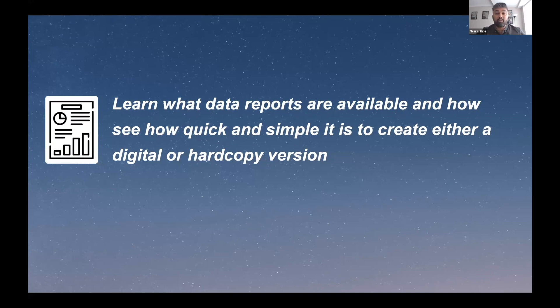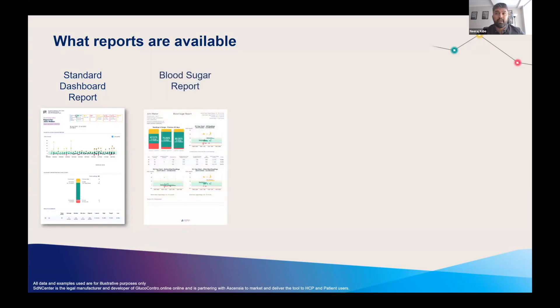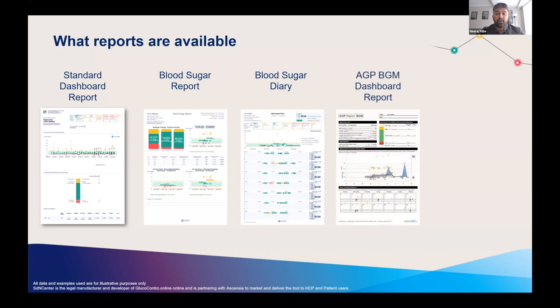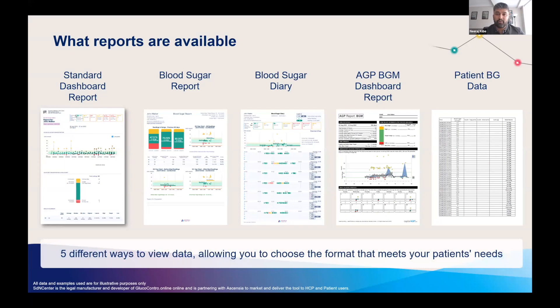Let's go through the different available reports. There are currently five output reports available within Glucocontro. The first is the standard dashboard report, the next is the blood sugar report, the third is the blood sugar diary. Glucocontro also allows you to view data as an ambulatory glucose profile or AGP, which is the fourth report, with the fifth report being a raw data output. Having different report formats allows you to pick the format to meet you and your colleagues' needs.